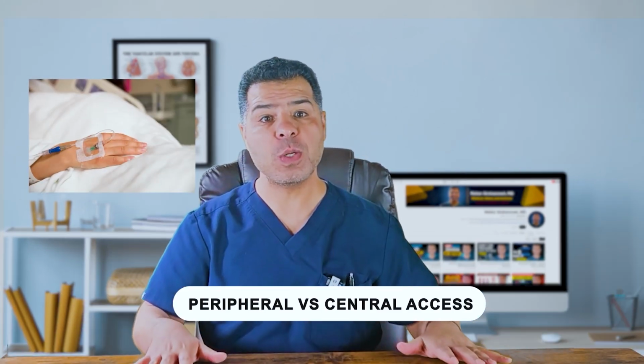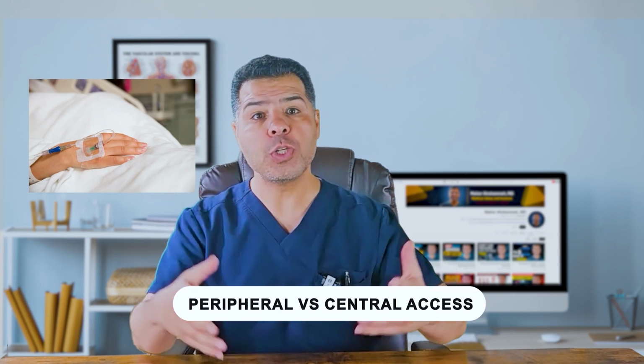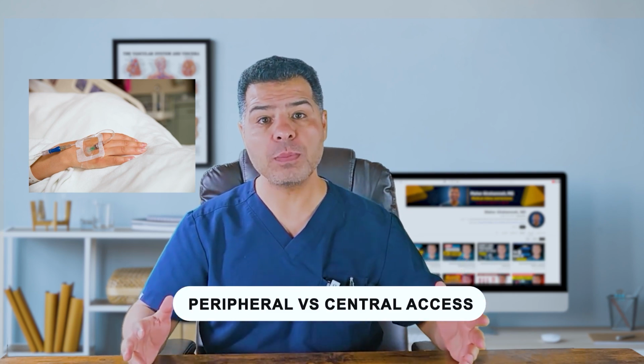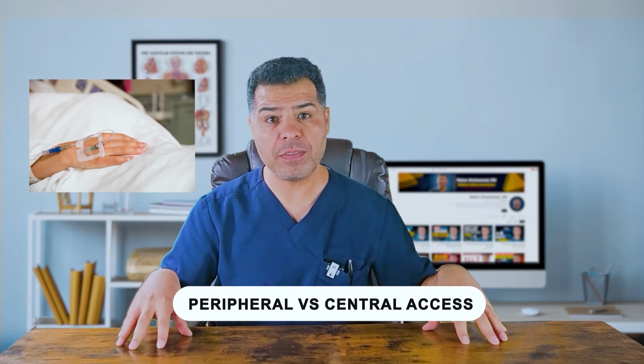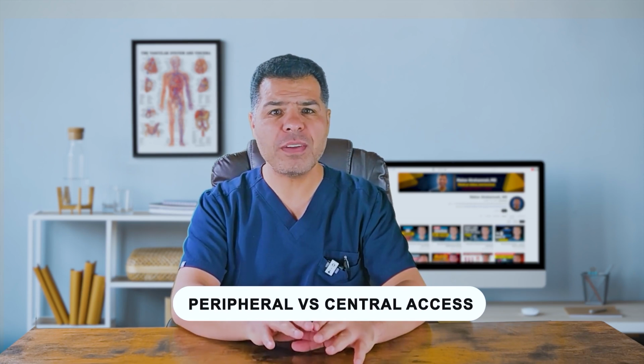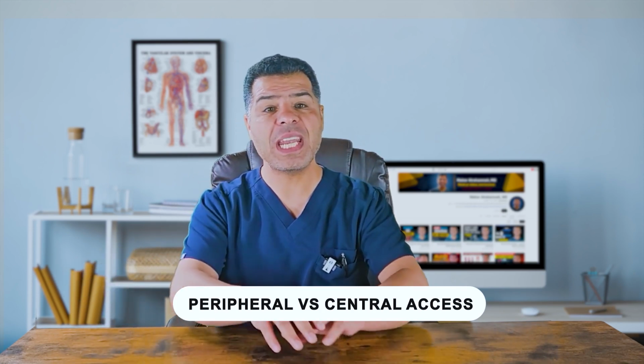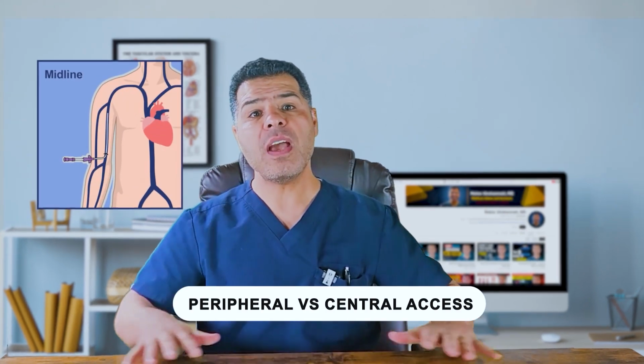Peripheral access includes the short IV, usually less than 6 centimeters, placed in the hands or the forearms. These are the traditional peripheral IVs. They are used for 3 to 5 days, and the foot should only be used if upper extremity access is not possible. Then we have the midline.